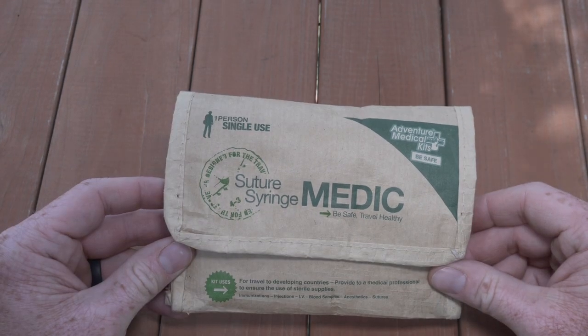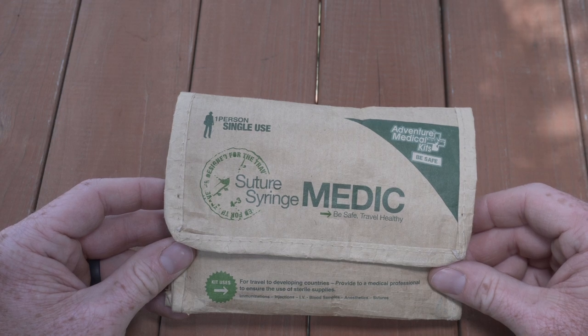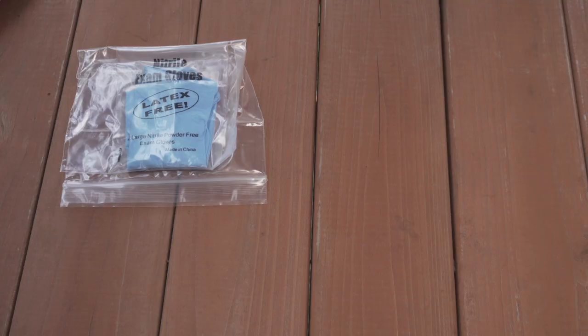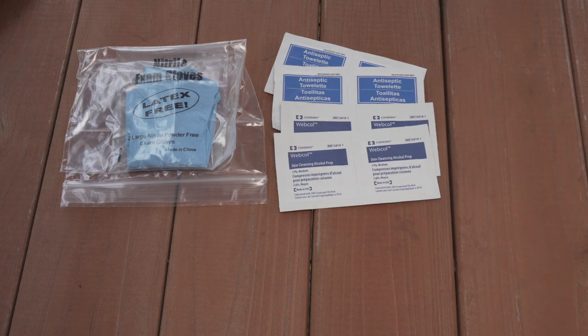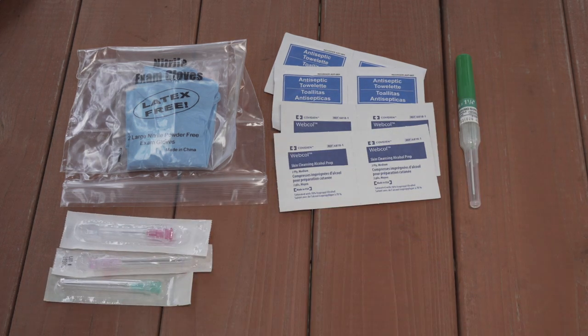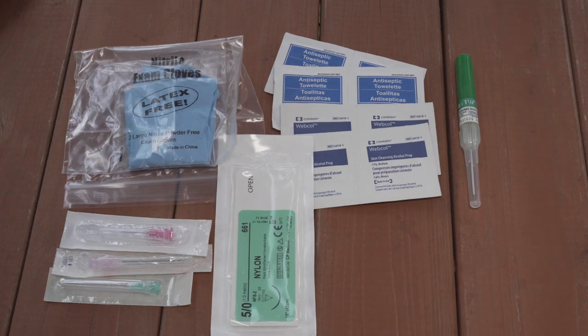Let's take a look at some of the items inside, and I will list all of the detailed contents in the video description below. This kit includes some nitrile exam gloves, antiseptic hand wipes, alcohol swabs, one angiocatheter, several disposable needles, a nylon suture, and a couple of syringes.